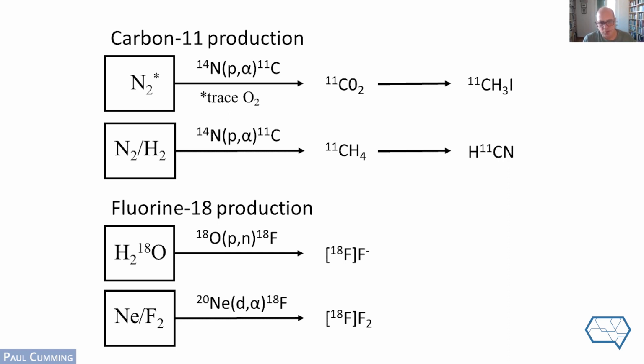But the important difference is a chemical one, that whereas many biomolecules and medicinal compounds normally contain a methyl group that could be amenable to labeling with carbon-11 methyl iodide, it's a relatively smaller range of pharmaceuticals that normally contain fluorine. But fluorine chemistry has developed in leaps and bounds so that there are now many different compounds that can be labeled with F18 for PET imaging.